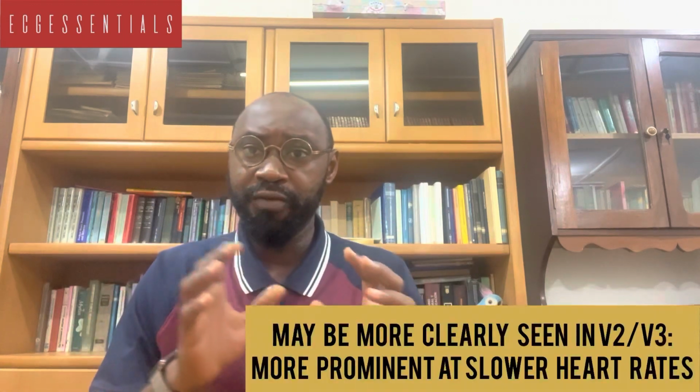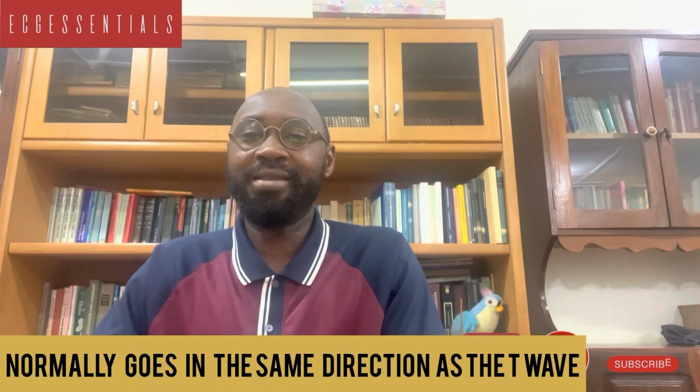Commonly, they may be seen in V2 and V3. So if you are looking out for them, those may be the leads that we have to pay attention to. Some attribute the origin of the U waves to delayed repolarization of the Purkinje fibers. Some also say that it is because there is prolonged repolarization of some of the myocytes in particular sites of the myocardium. But for us, what is important is that when we find the U waves, we expect that normally they will go in the same direction as the T wave.